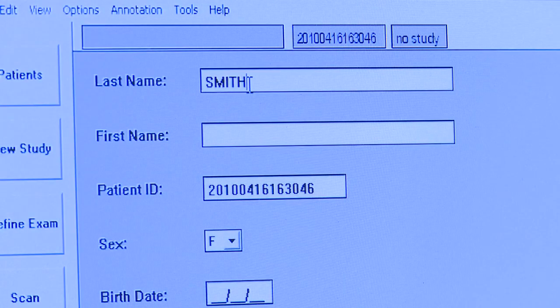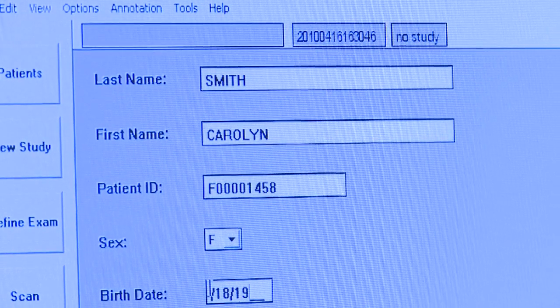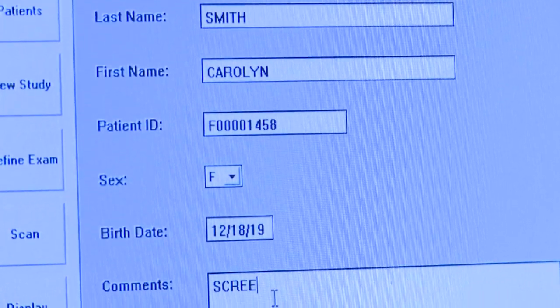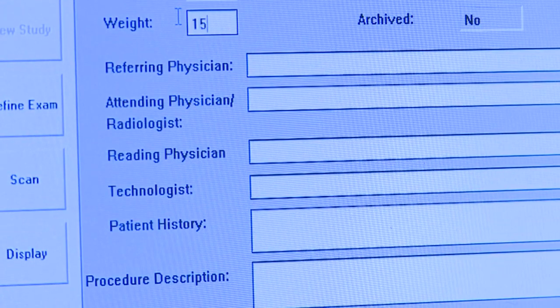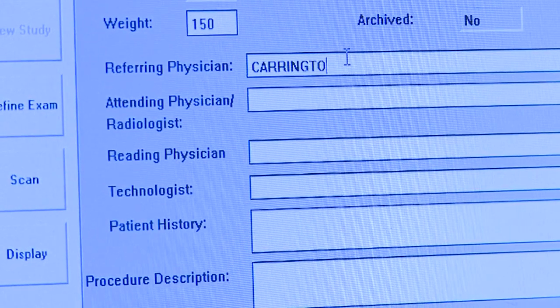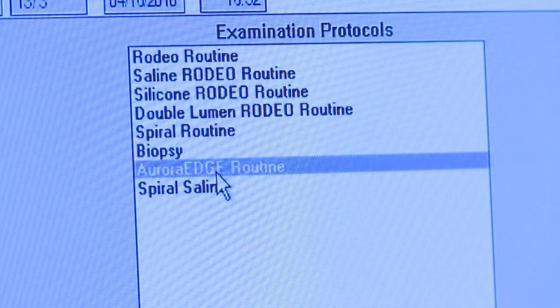So we open up our database. What we do now is enter the patient into the database and we'll start scanning the patient. Last name and then their first name. We use their Faulkner ID, female, her date of birth. And then we put in information as to why we are doing the scan. We put her weight in, the referring physician, and our initials.